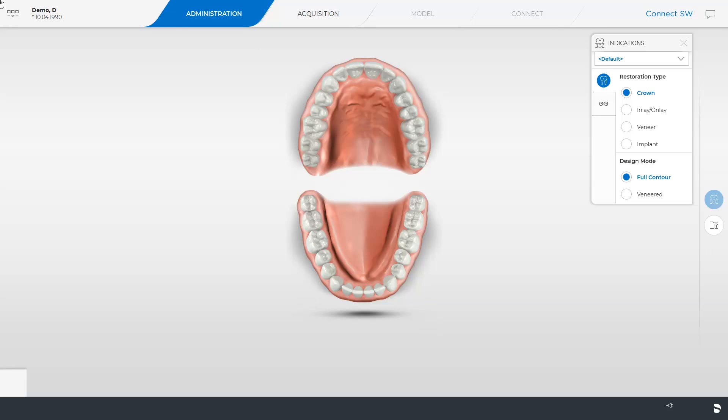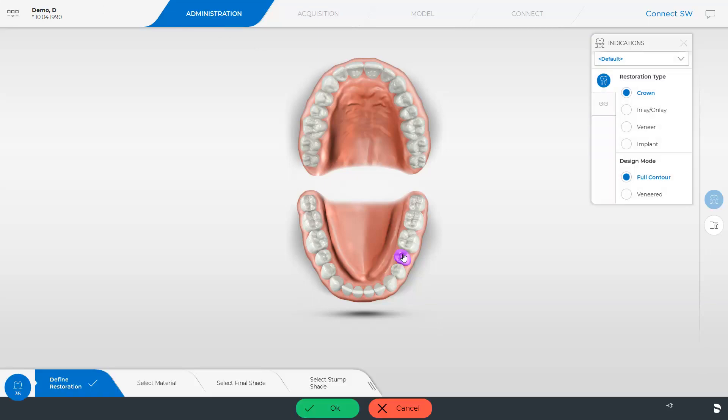We are in the administration phase of the Connect Software 5. At the right edge of the screen, we determine the restoration type and the design mode for our case. Then, we set the position in the odontogram. After clicking OK, we may already switch to the next phase, the acquisition phase.